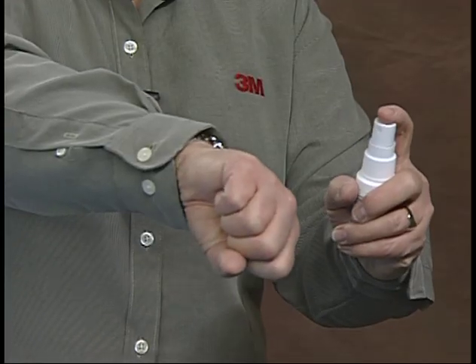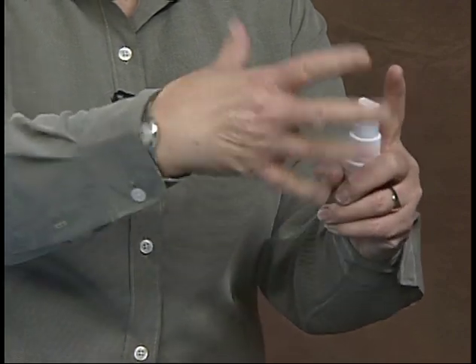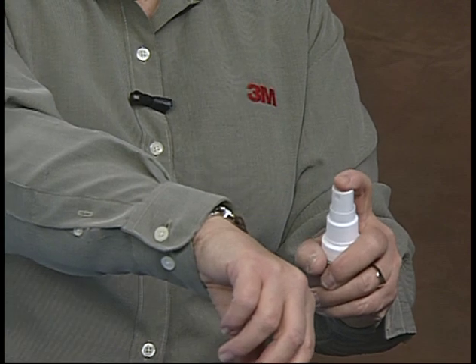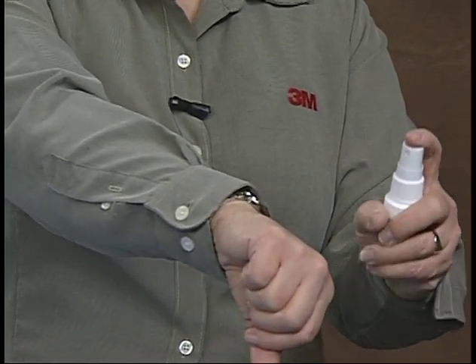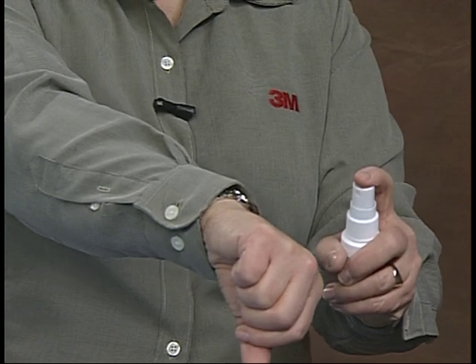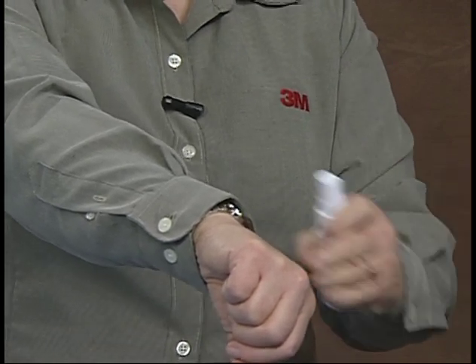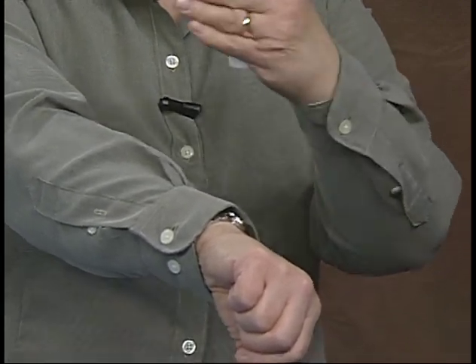You want to hold the bottle about four to six inches away from the skin. Sometimes, especially on the first use when you first open a bottle, you may need to prime the bottle a couple of times with a couple of pumps to get it started. Once you've done that, again holding about four to six inches away, spray to cover that area, then move to the next area that needs coverage, just as described with the wipes.